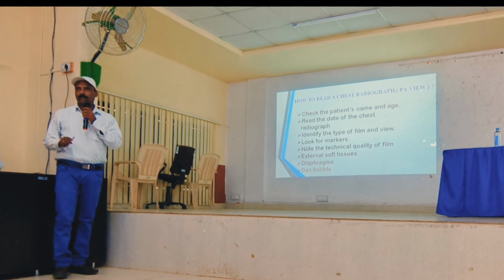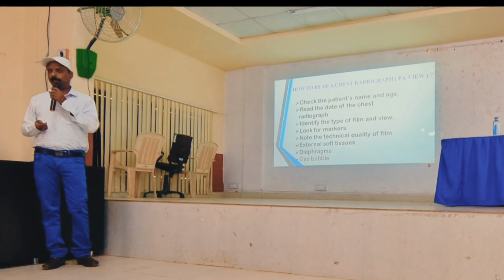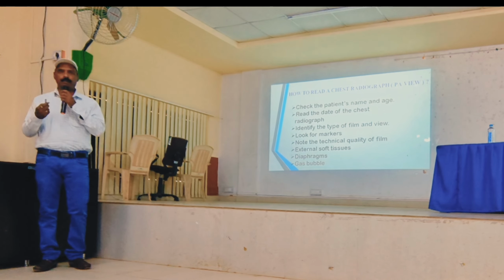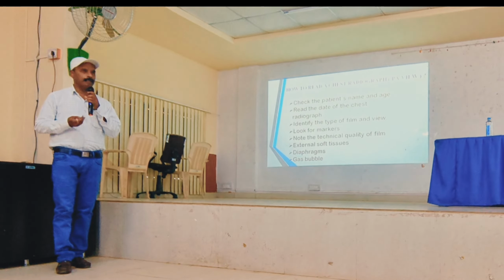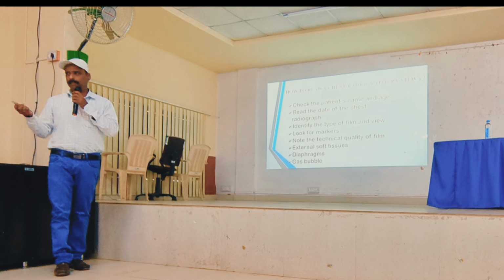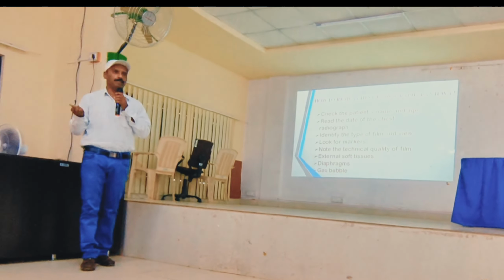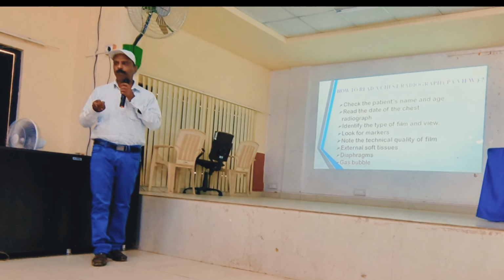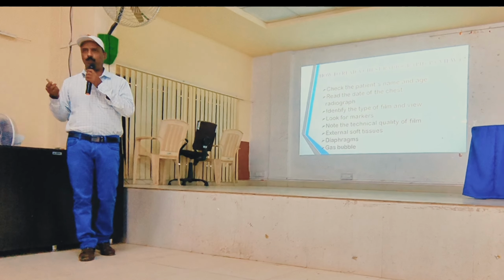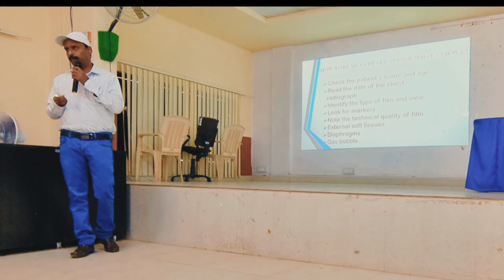So when you see the PA chest, what you have to check? These points are the expected things from the examiners in practicals, in spotting. I know the National Commission has made spotting, and two radiology questions are fixed, of 5 marks each. They are divided as 1, 2, 2, so in one question you have three subdivisions.